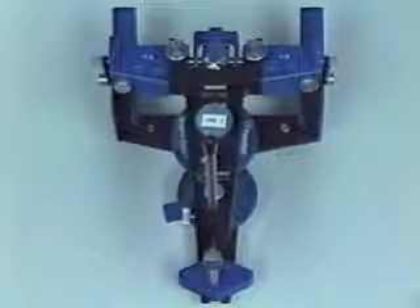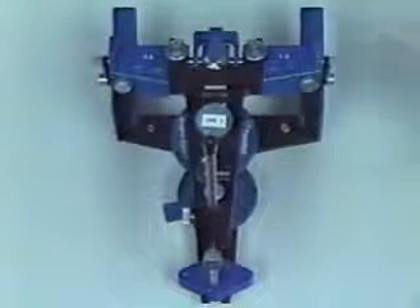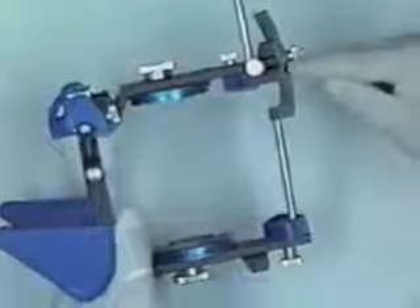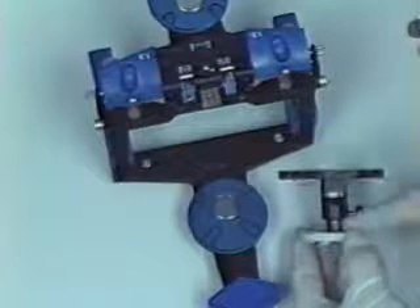In preparation for mounting to the Panadent articulator system, a few initial steps must be verified. Number one, the pin must be set at zero. In addition, the centric latch must be engaged. The adjustable mounting platform is set at the zero position on the index.